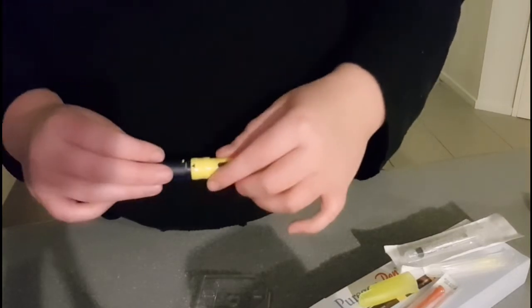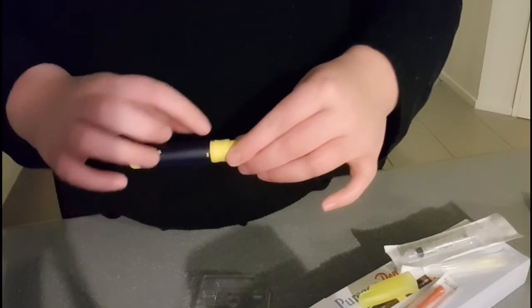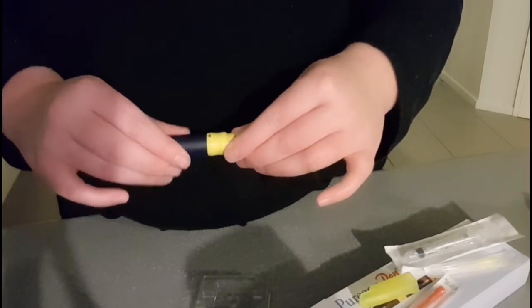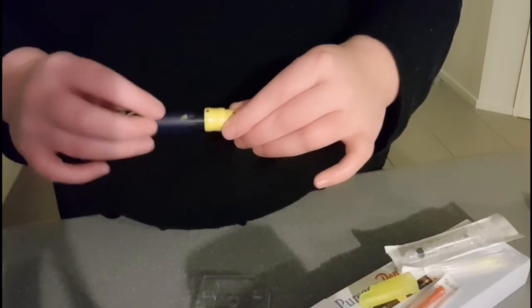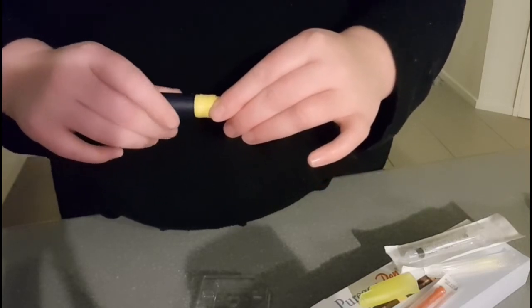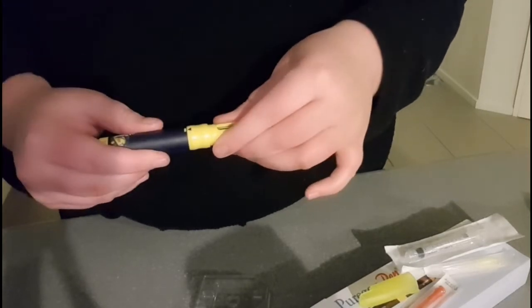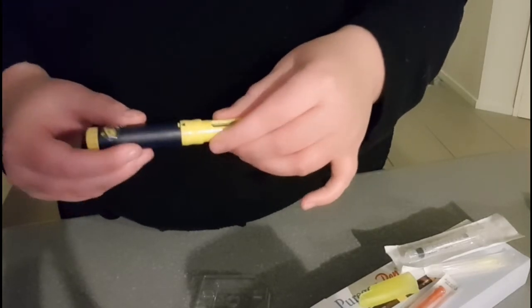I'm shaking — look at it to make sure it's all okay. Silver side down I think. They didn't give me any swabbing things; they said I didn't need to do that. I'm going to tighten it so that yellow line — okay, that's meant to line up with that. Yep, that's good — you don't want to do it too tight.